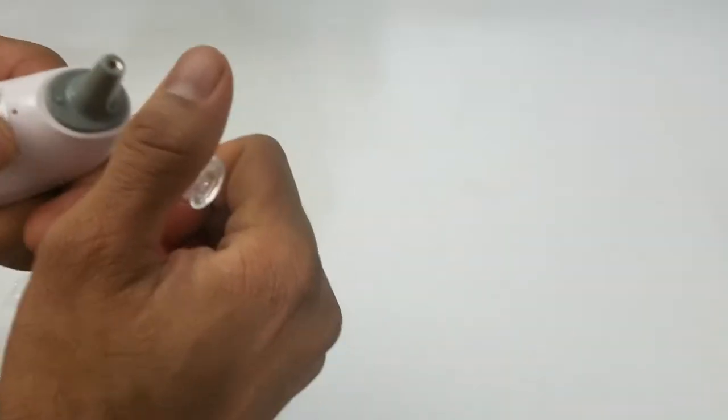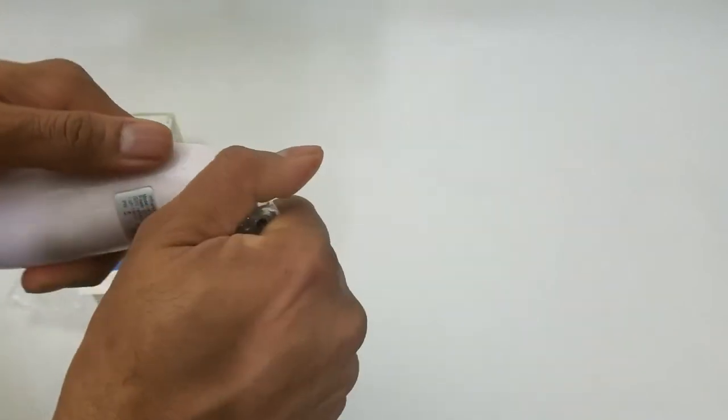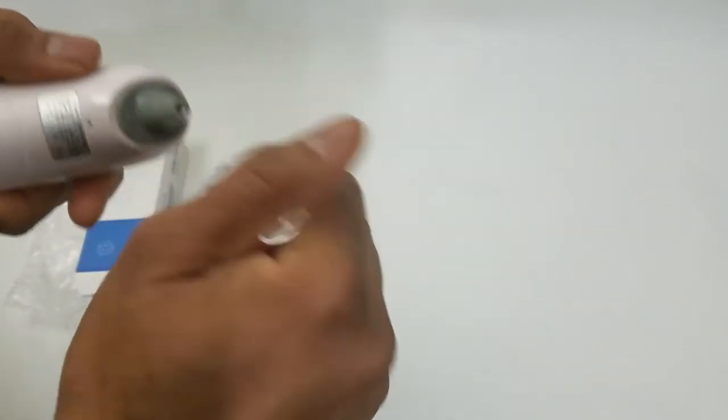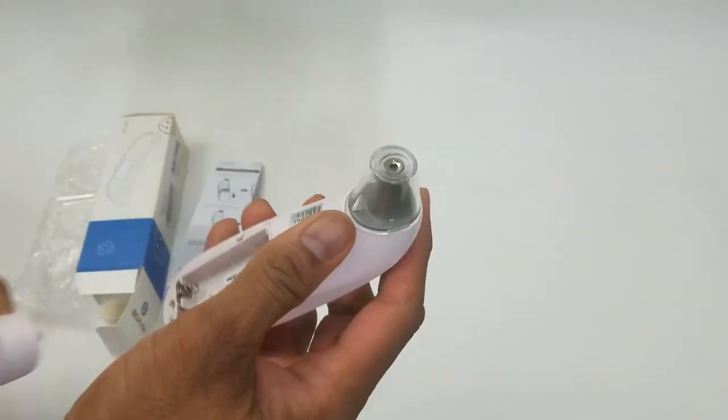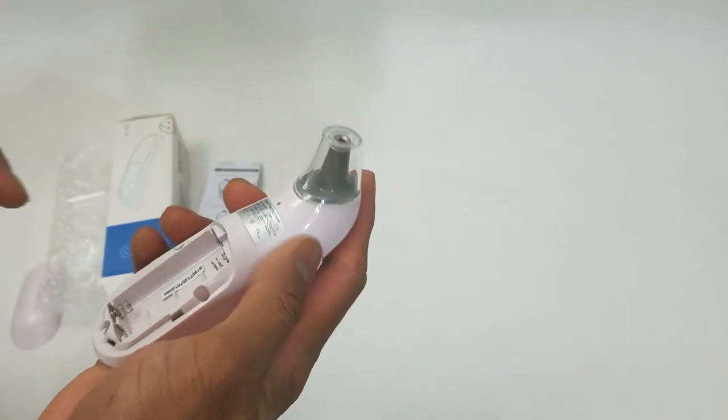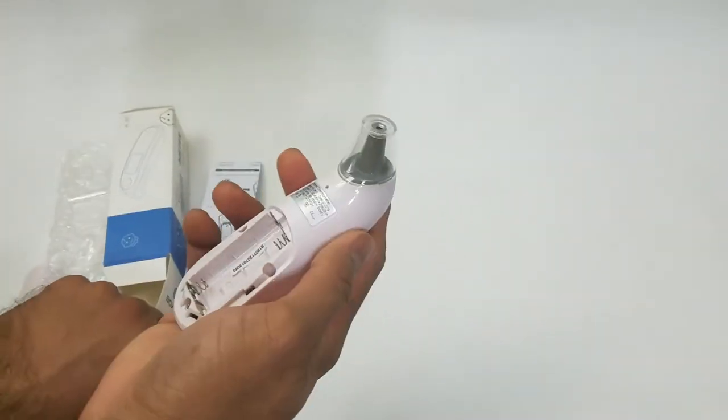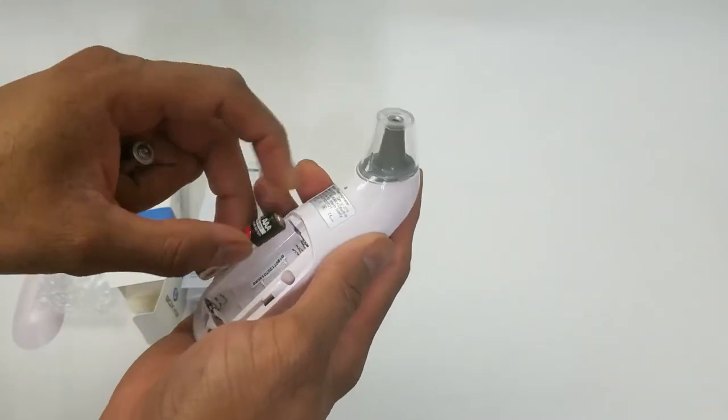Just a simple twist action. Twist it back on, twist it back off, comes right off. Open it up and put in two AA batteries.